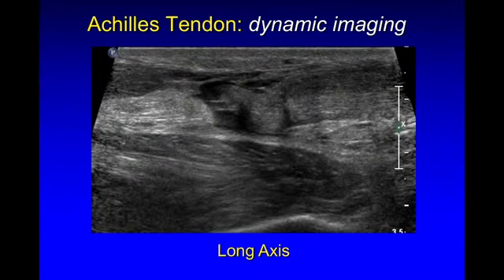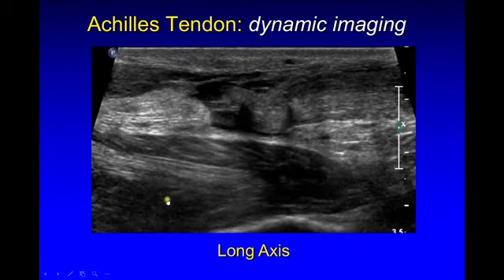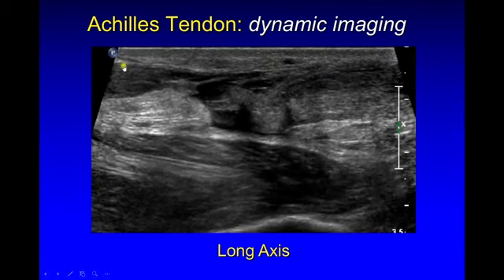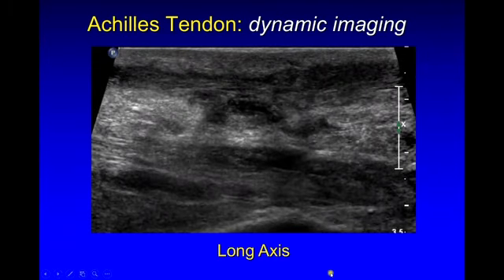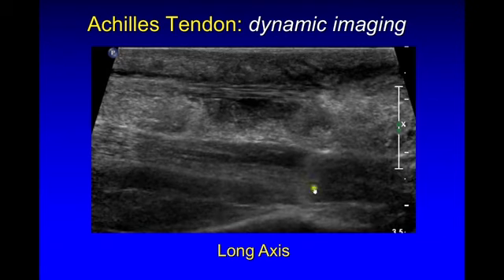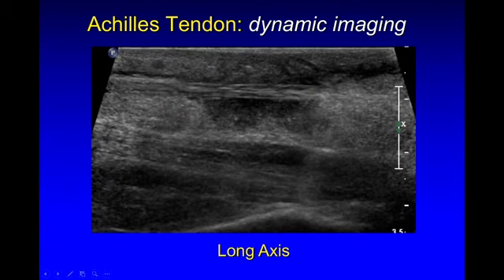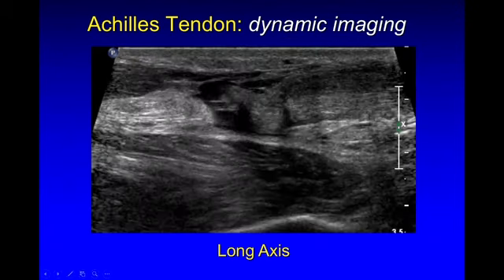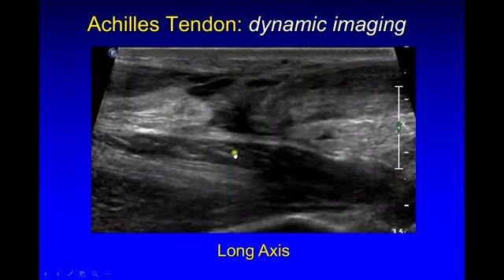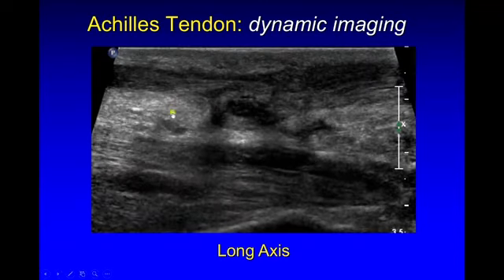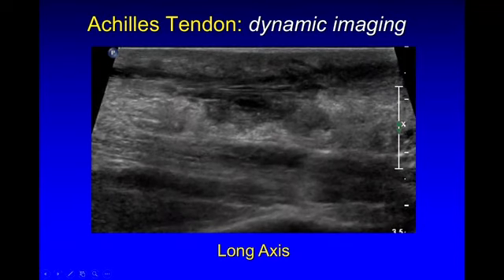Dynamic imaging is very helpful in this scenario. With the patient lying on their stomach, if you dorsiflex and plantarflex the foot, you'll bring out retraction of one tendon stump compared to the other tapered end, confirming a full thickness tear. At the medial aspect, this intact tendon is the plantaris, which should not be misinterpreted as intact or spared Achilles tendon fibers. The FHL, or flexor hallucis longus, is also visible, and the echogenic triangle here is Kager's fat pad.